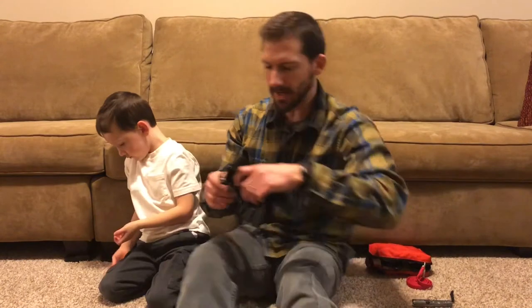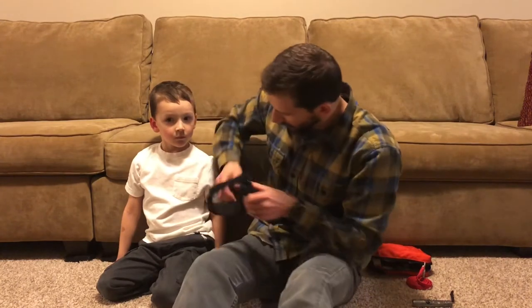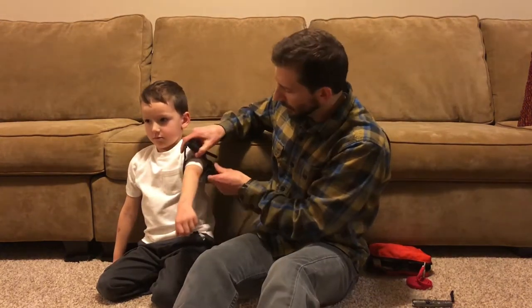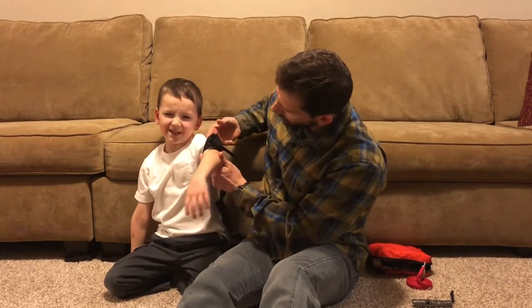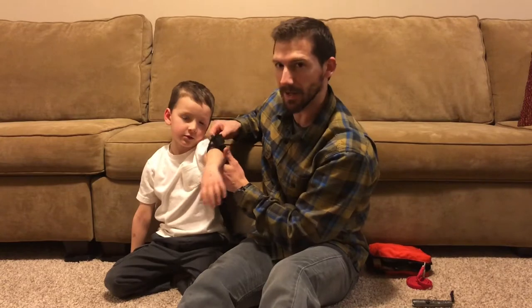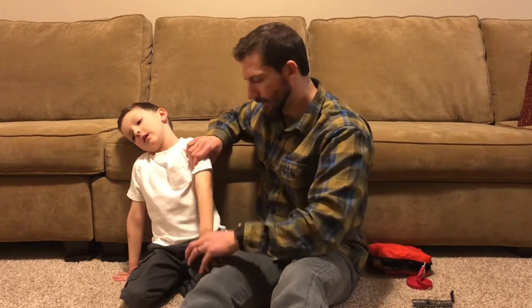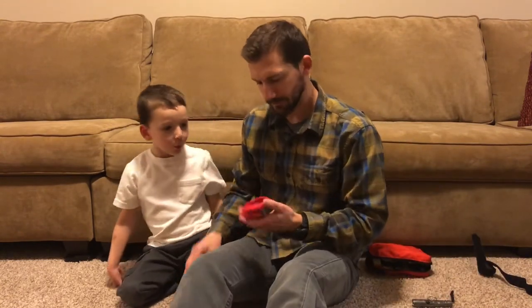Now with the Combat Application Tourniquet on kids, you'll notice there's a rigid part here, and depending on the size of the extremity it might not get small enough for a child. You can see there's a gap — I can get two or three fingers in there — and it's just not going to cinch down tight enough, which is why I'd like to show you the Rapid Application Tourniquet.